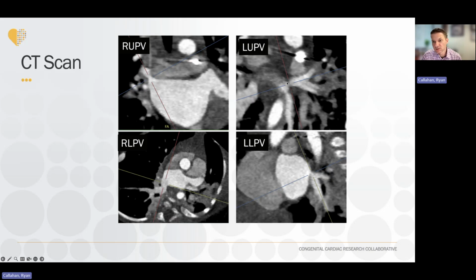But the resolution is not perfect, as you can see, to potentially tell you what exact percentage it is, but you can kind of get a sense that these are probably nearly all going to be in the normal to moderate category. The left lower looks like it is severe, but the resolution isn't that great to tell for sure.